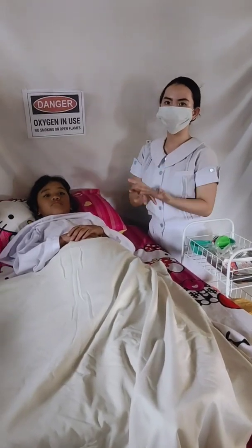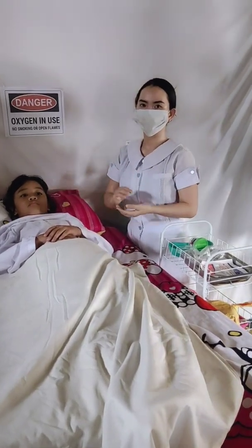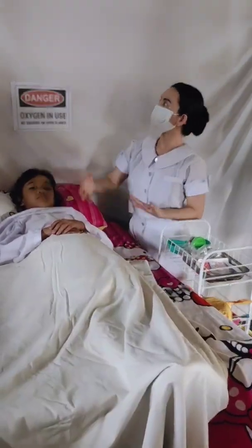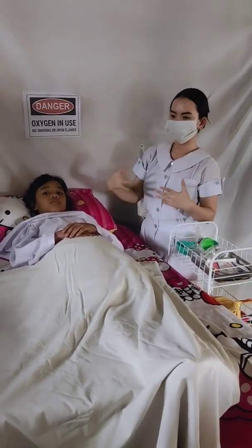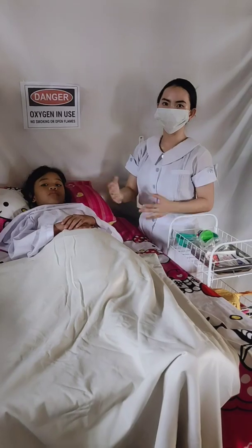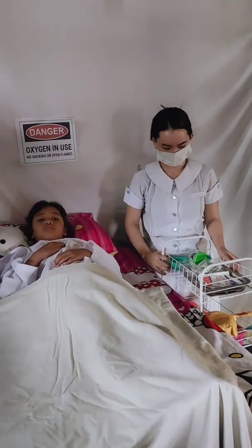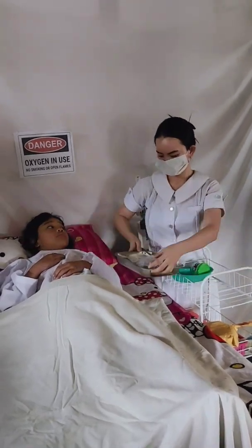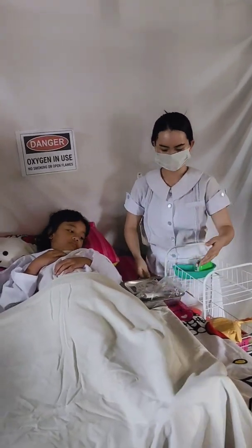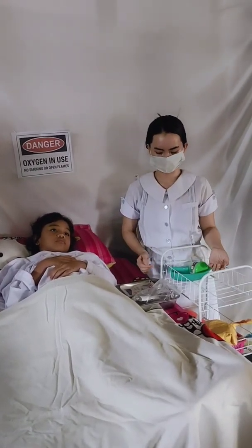First, perform hand hygiene. This is to prevent gross contamination between the nurse and the patient. To make the client comfortable, provide client privacy by closing curtains around the bed and closing the door of the room if possible. The last for the planning is obtain and place necessary equipment at the patient's bedside. The rationale for doing this is to easily access the equipment needed for the procedure.